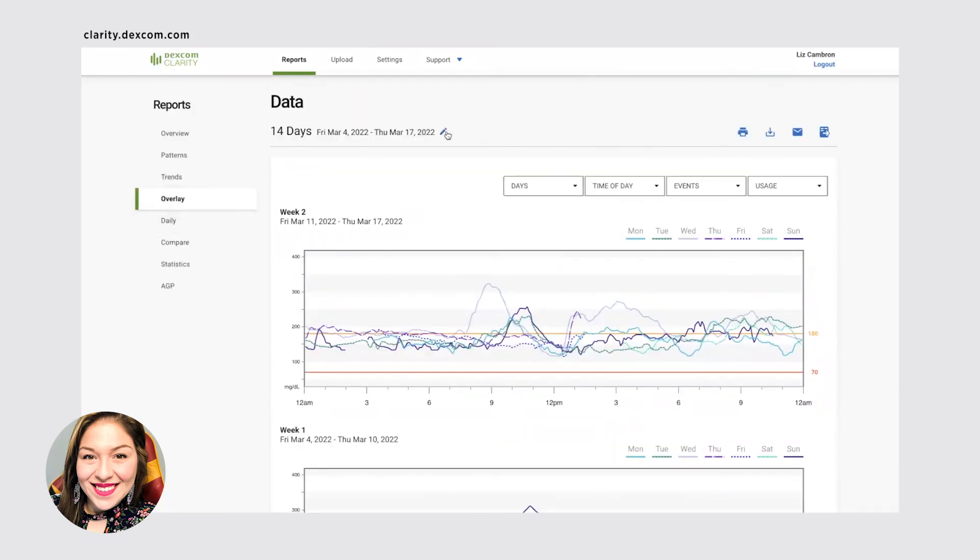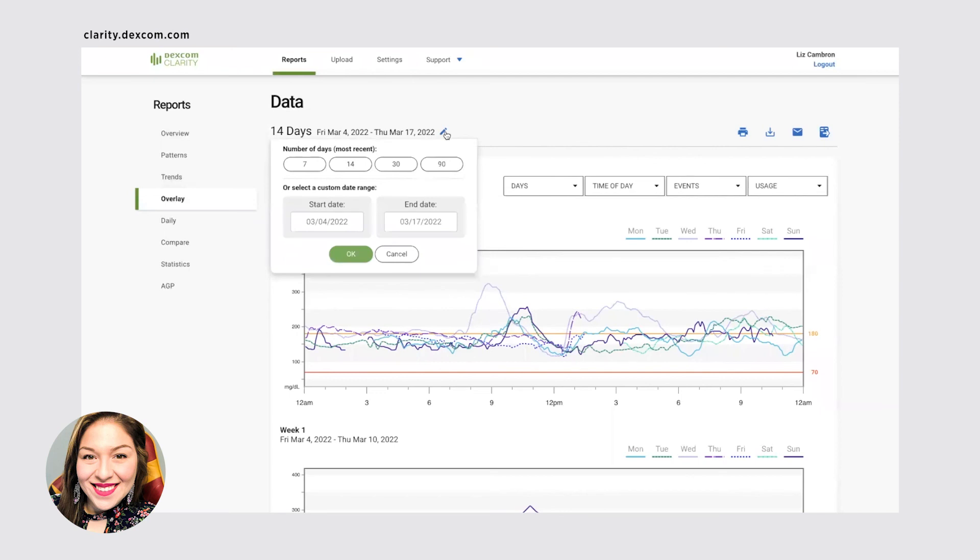And it shows you for specific weeks. And that is adjustable. If you click on this little pencil, you can select if you want data from the past seven days, the past 14, 30, or 90 days, just like the mobile app does.